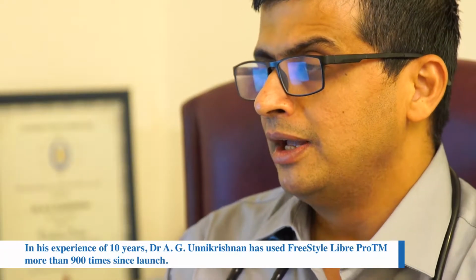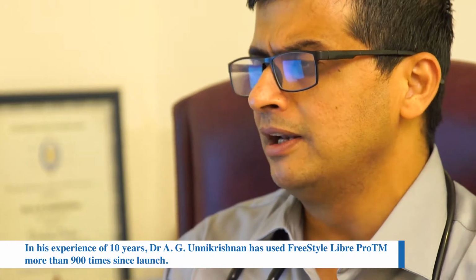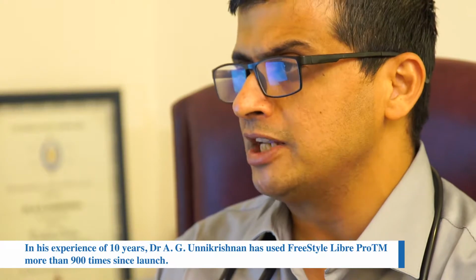Somebody whose HbA1c levels are high, but when the patient tests his or her blood sugar with a glucose meter, they find that those values are normal. I think to address this discrepancy, we use ambulatory glucose profile. We also use it in situations where patients complain of hypoglycemia which has never been confirmed, in patients who worry about their glucose levels falling during the night.